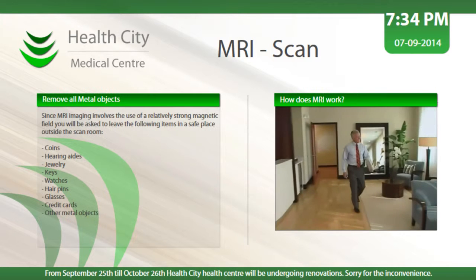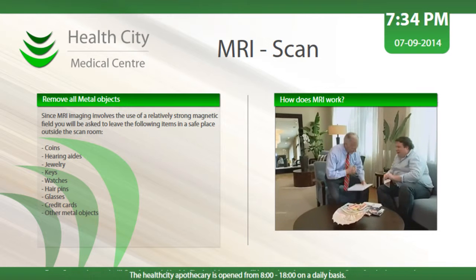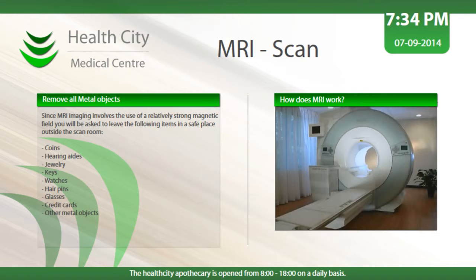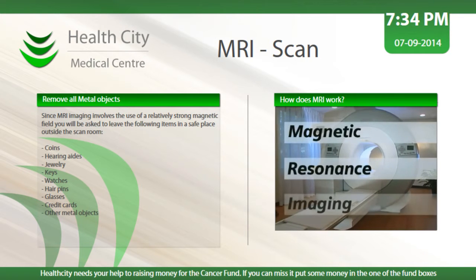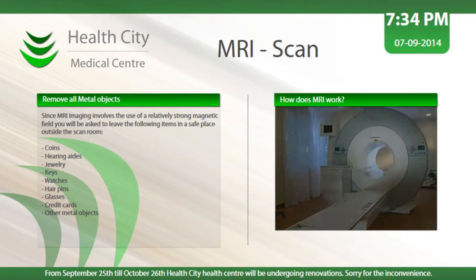Welcome to this MRI Patient Education videotape. Your physician has ordered an MRI medical condition. What is MRI? MRI stands for Magnetic Resonance Imaging, and for the next few minutes, we'll discuss the MRI examination.